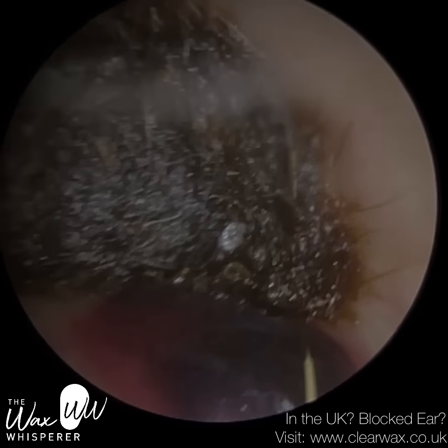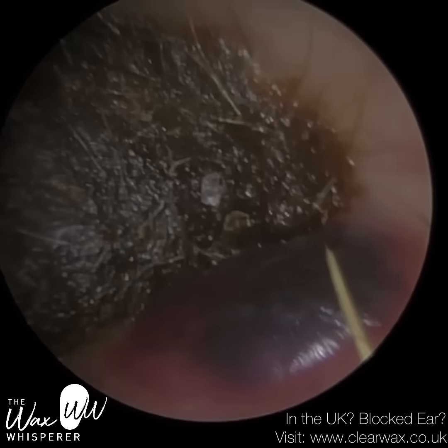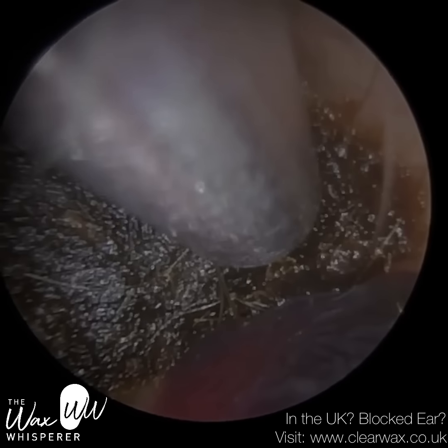And also all the bruising around the ear canal. So I had to take what the patient said with a pinch of salt on this occasion. And you can see it's really bruised at the base of the ear canal.